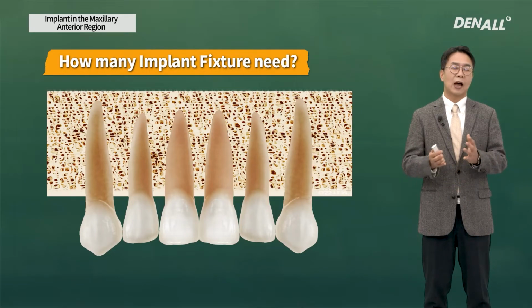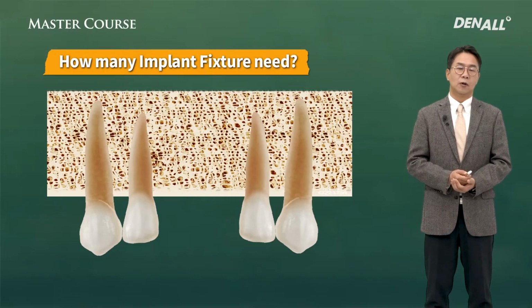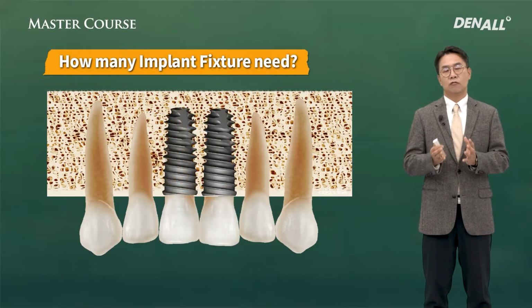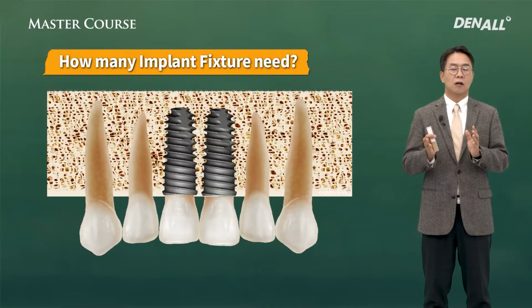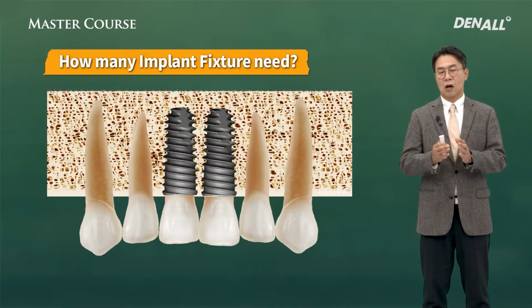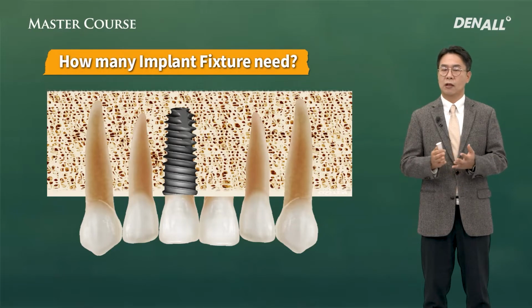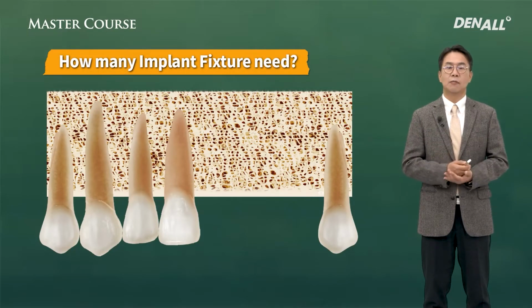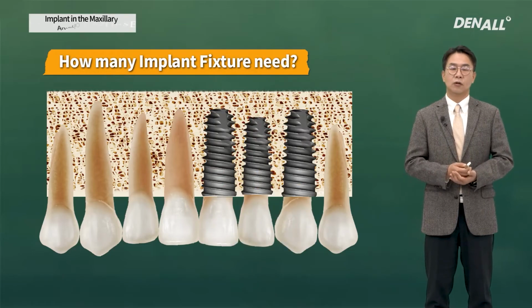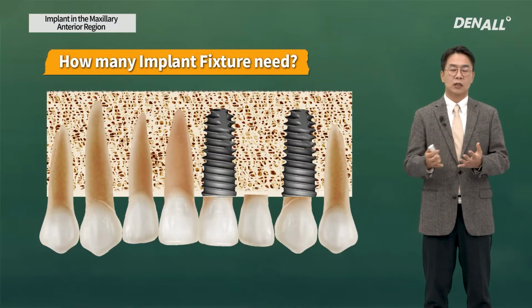However, the problem is when more than one teeth are missing, like number 2 and number 1, we can place 2 implants, but depending on the edentulous span, we can restore one and the other one cantilever, but there can be something like this. When 3 or more are missing, we can place 1 for each, but depending on the shape of the space, we can use a bridge.